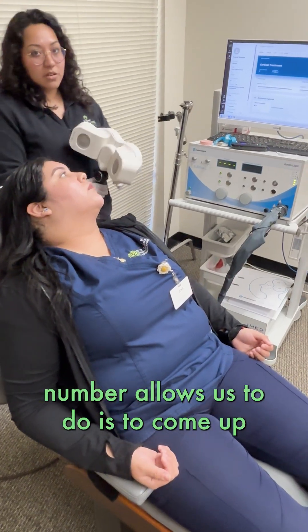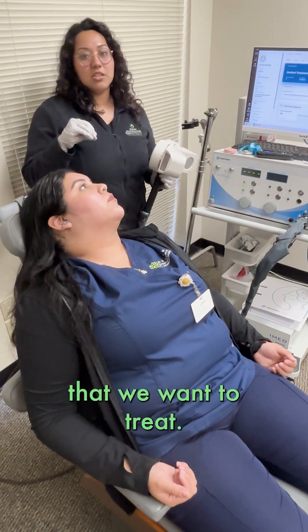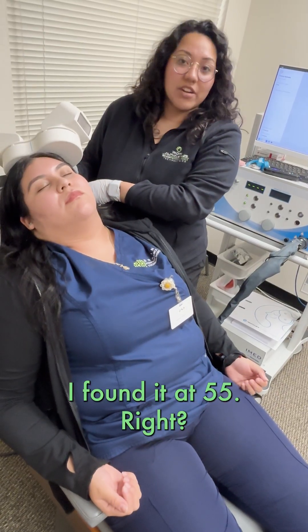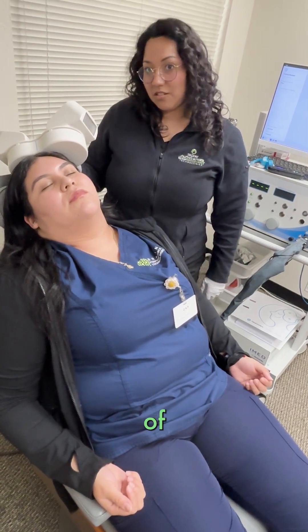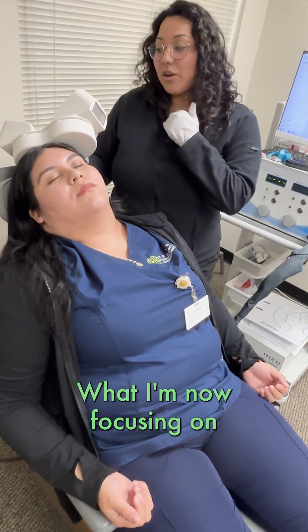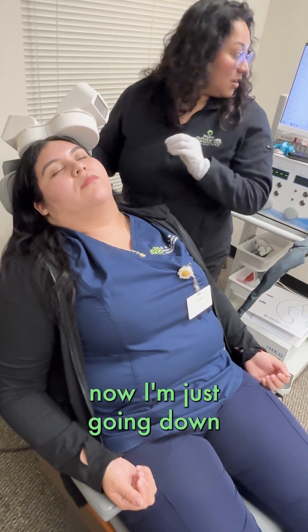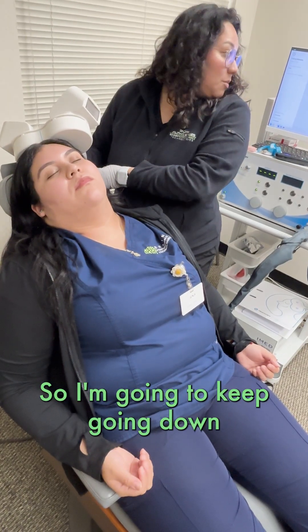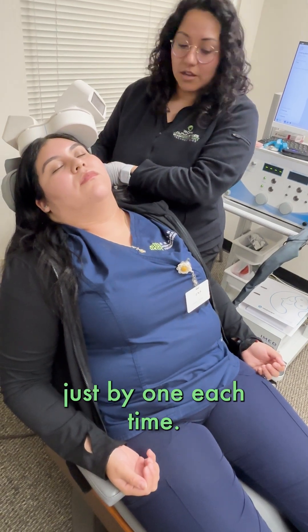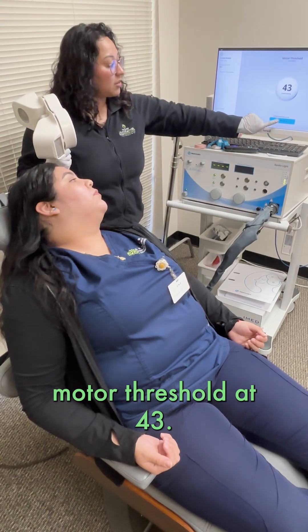The motor threshold number allows us to determine the exact percentage we want to treat. I found it at 55, which means I found the exact location of her motor cortex. Now I'm focused on not moving the coil since I found that spot, so I'm going down until I don't see it anymore. I still see movement in her fingers, so I keep going down one at a time. At 42, I didn't see it. At 43, I did. So we're going to set her motor threshold at 43.